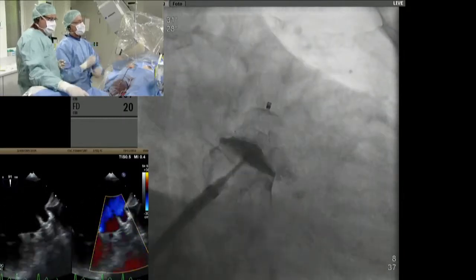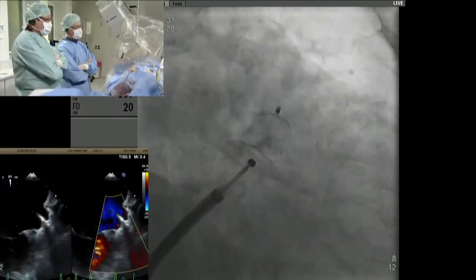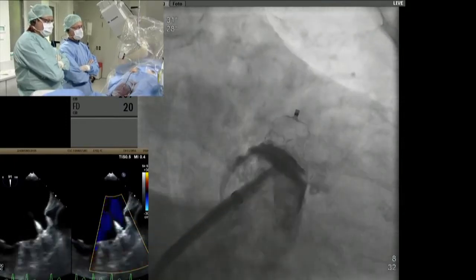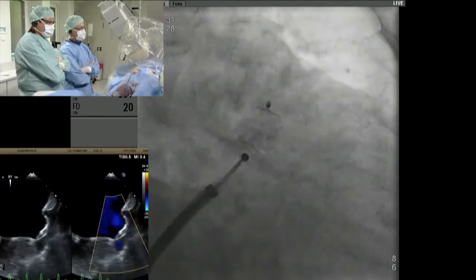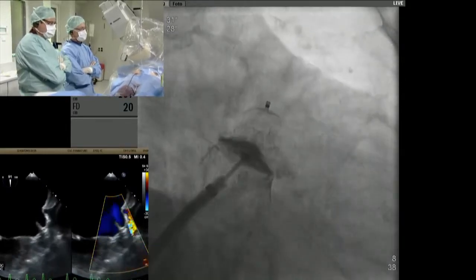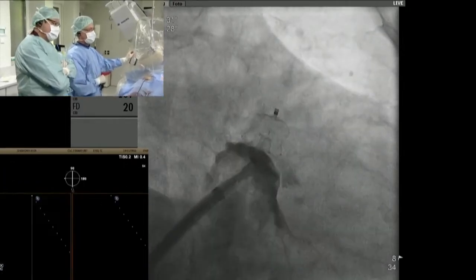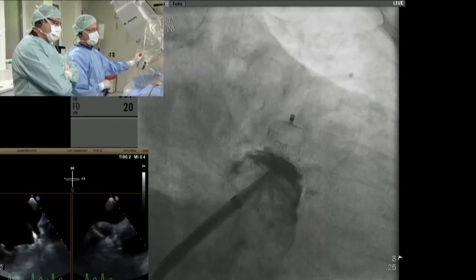Maurice? The question is what happens when we release the device. So it could be there's half of it that's uncovered. You can see it on angio. Yeah. So I think that's too small. I just worry that if you try the 25, Horst, there will be no landing zone for that. The way that lobe has gone in is what we probably do want, and maybe it's just that the 18 is too small. We go only one size up, and that might cover it.